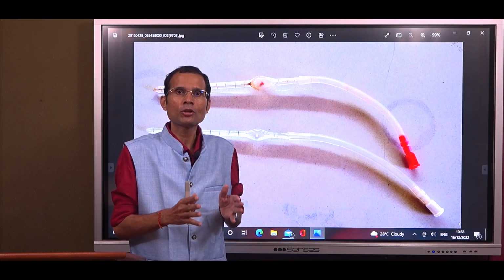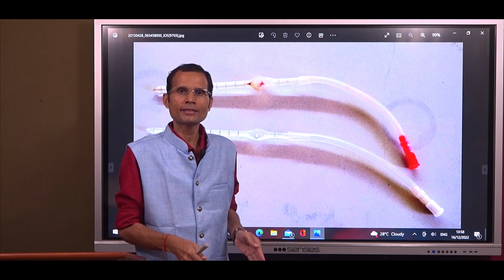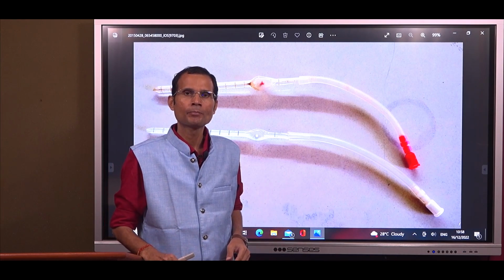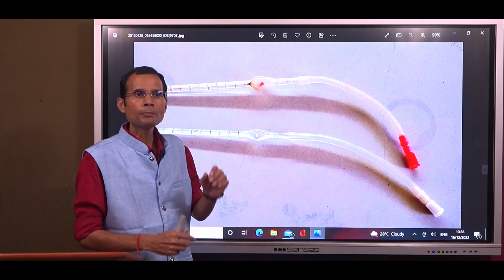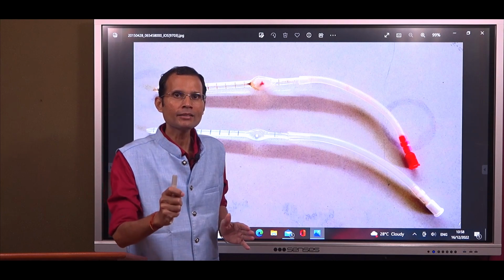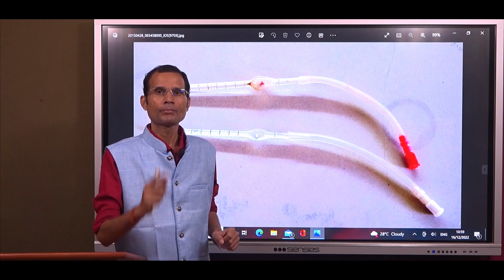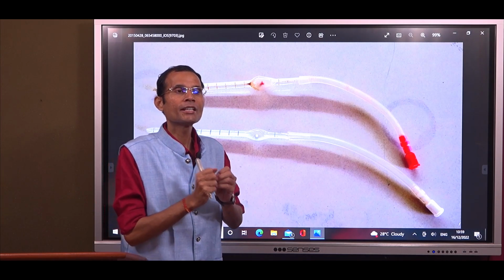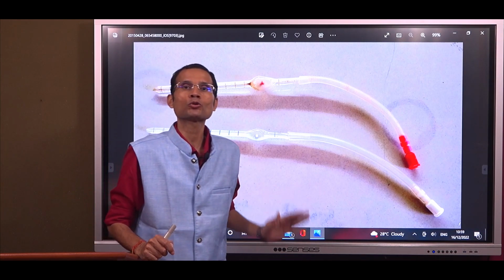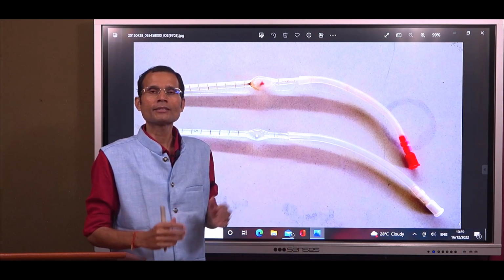That will be too much crowding of cells, and therefore it will be humanly impossible to count those many cells in that small a space. Virtually impossible. So what we actually are up to is that we will first dilute the blood sample, means, now note this word, we are going to disperse the cells. Dilution of blood sample means dispersion of cells so that we can count them manually under the microscope. Alright, that's the reason why we need dilution of the blood sample.